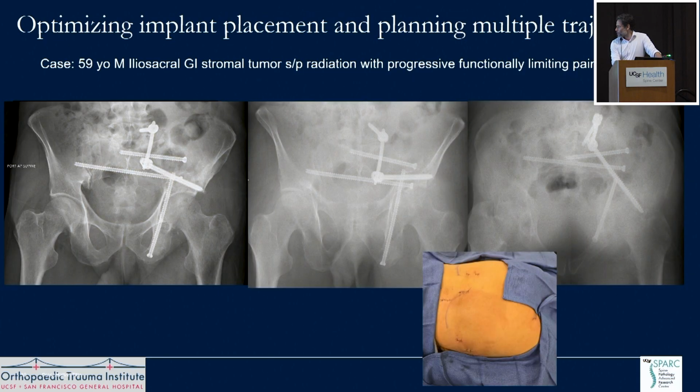You could plan your incisions. So you could see the skin changes there from his prior radiation that you can really try to stay out of to get him back to weight bearing.